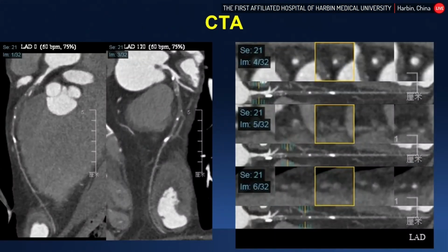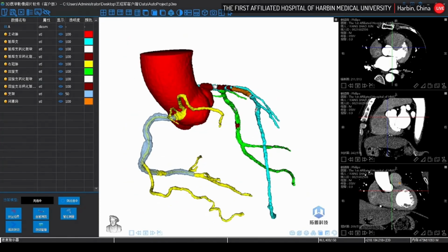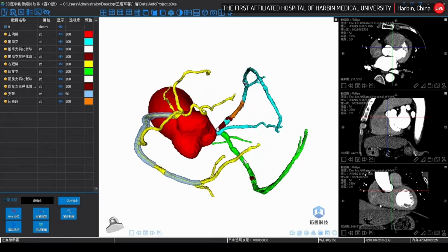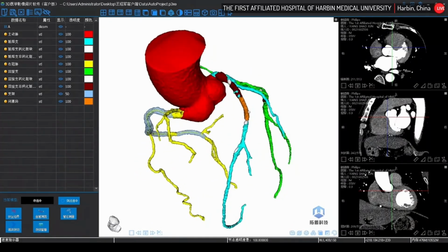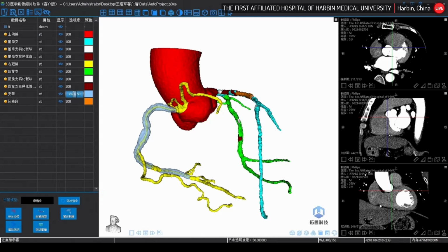Next, Professor Wang Dingyu is going to demonstrate the CT angiography reconstruction software developed by our facility. Let's check the CT image. This is a reconstruction of the general CTA. I think Professor Li Yue has given live demonstrations of this software several times. It is a very unique and helpful software, especially for CTO procedures. You can detect the detailed plaque distribution as well as the composition of the plaque before you touch the patient, which is of great value to help you set up the strategy for how to perform PCI for this patient.